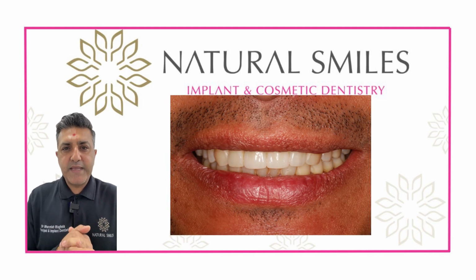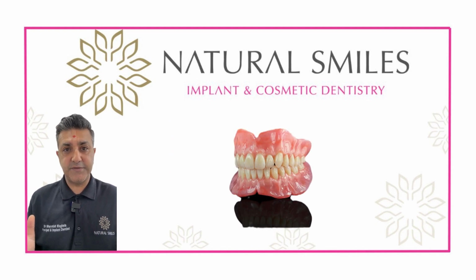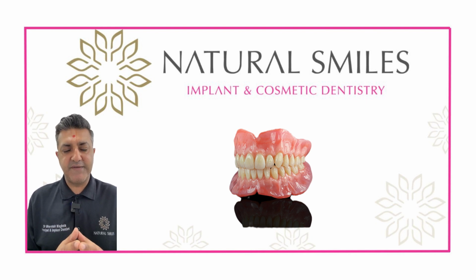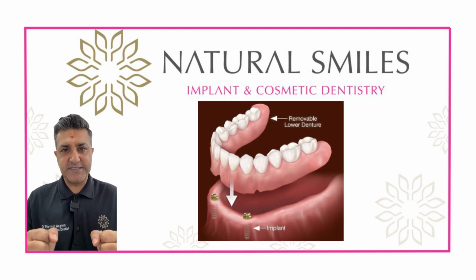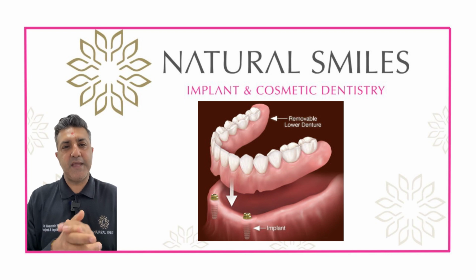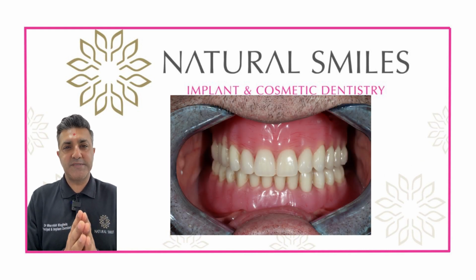Other scenarios where dental implants can be used are for patients who are already missing all their teeth. They may be wearing dentures and the dentures are problematic. And as a result of the problems they're having with the dentures, we can use the dental implants to, in effect, stabilize the dentures. The dentures are basically removable teeth which would fit over the implants, and they tend to provide a really good way to alleviate the problems that patients have with problematic dentures.